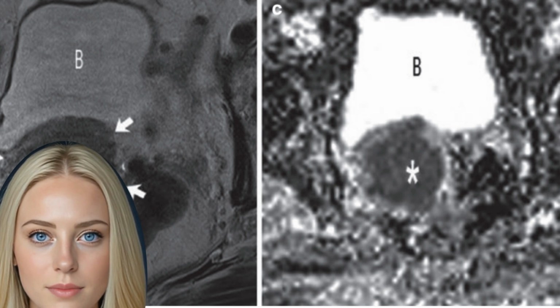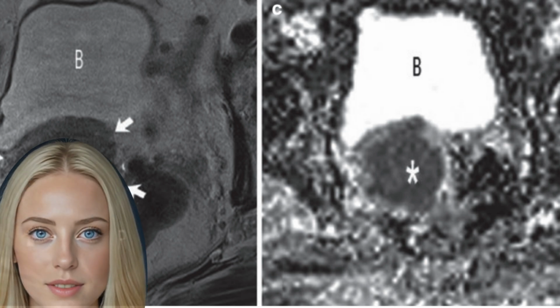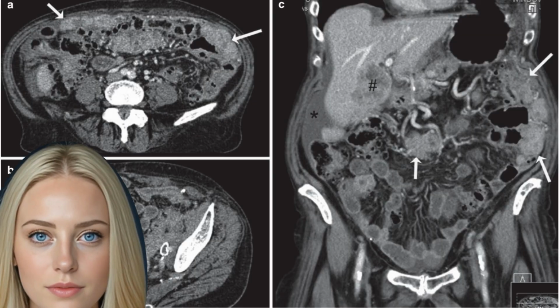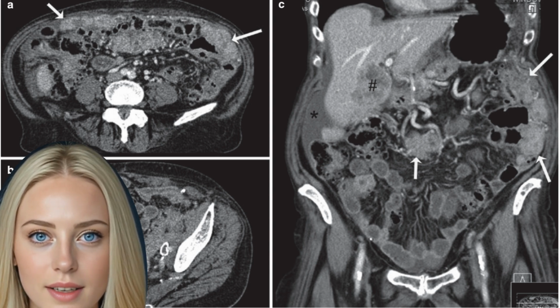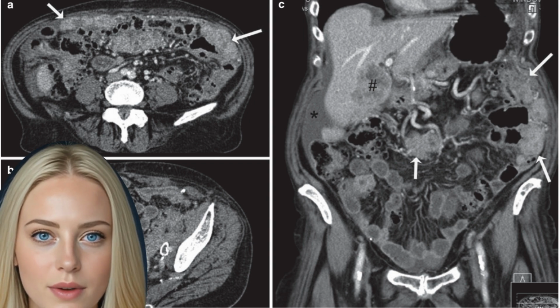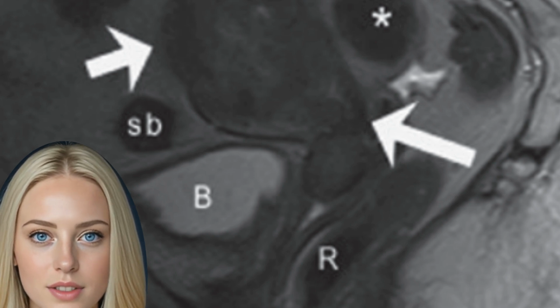If there is already a clinically based suspicion of a tumor extent beyond the small pelvis, a CECT of the abdomen for therapy planning and for follow-up examination should be initiated for the visualization of local findings. Contrast-enhanced MRI of the pelvis ought to be the image modality of choice. Using MRI, uterine lymphomas are mostly visible as homogeneous, hyperintense masses in native T2WI, without a clear differentiation to the surrounding tissue and with a strong enhancement after contrast application.